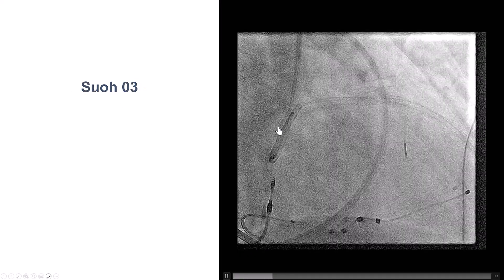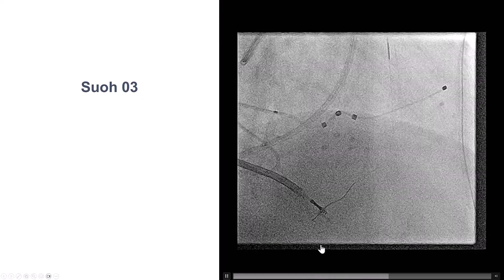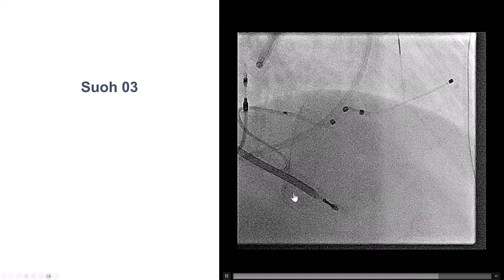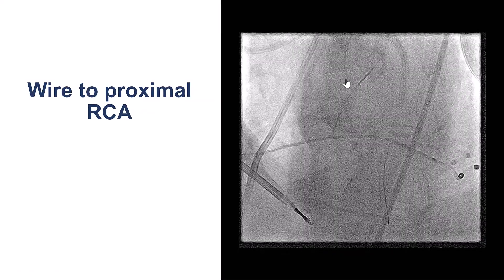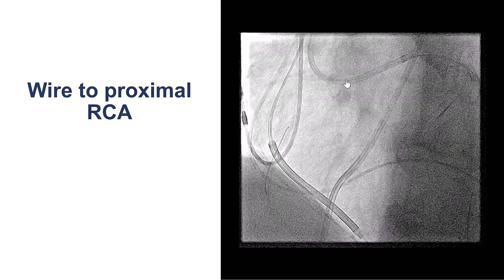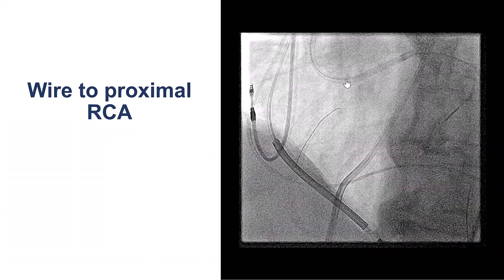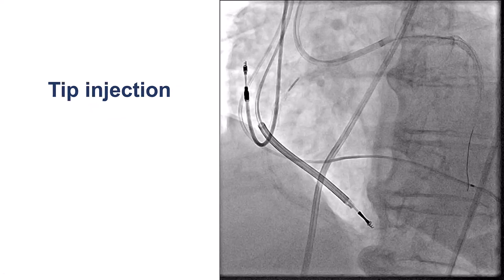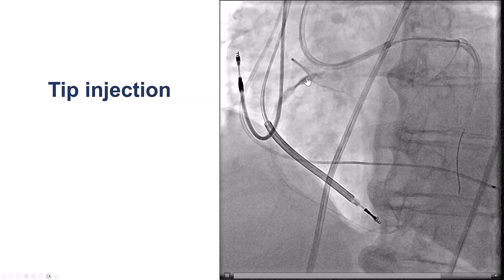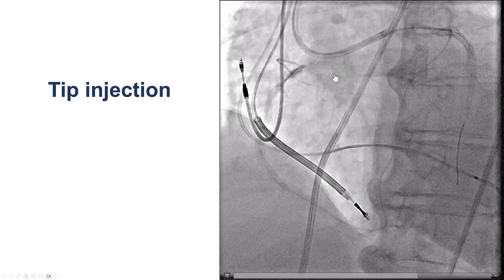We then did surfing using a Suoh 03 guidewire, and the wire very easily went right down straight into the PDA and all the way into the proximal right coronary artery. Fairly easy crossing of the septal collaterals that were well developed, and the wire is essentially all the way to the proximal, confirming that this is a relatively short CTO. Here is a tip injection after we delivered the Turnpike LP all the way to the proximal, and we do see the calcification of the proximal right coronary artery.